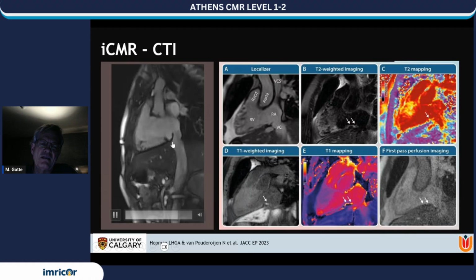And you can imagine that that affects the quality of the ablation lesion, and that we are now aware of this because we can make it visible. But this is also, of course, the case under fluoroscopy, but then you cannot see it. So we will get, and do get, a lot of information from imaging during ablation procedures, ranging from location, deformation, and position of catheters. And on top of that, we have the different imaging strategies, which give us some information regarding the lesions created, as shown over here as an overview.